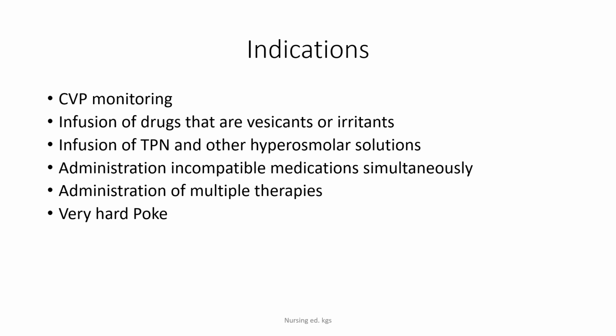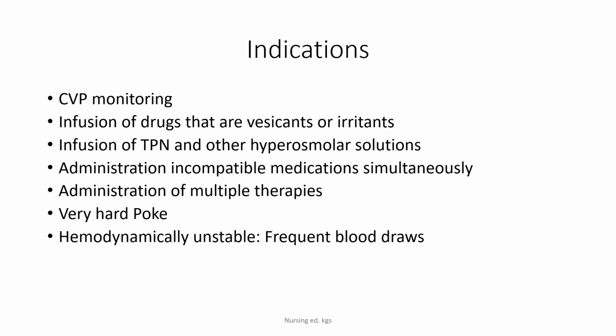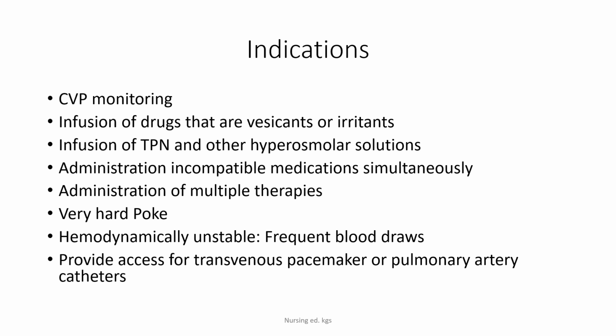It may also be inserted if the patient is hemodynamically unstable and may need frequent blood draws, for example, in the context of DKA, diabetic ketoacidosis, hemodialysis access, or to provide access for transvenous pacemaker or pulmonary artery catheters.